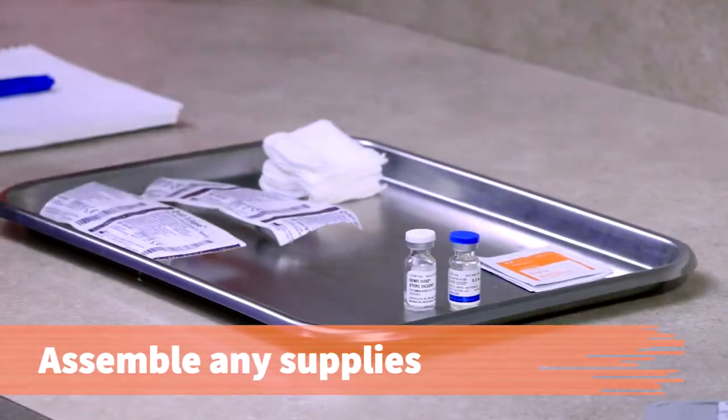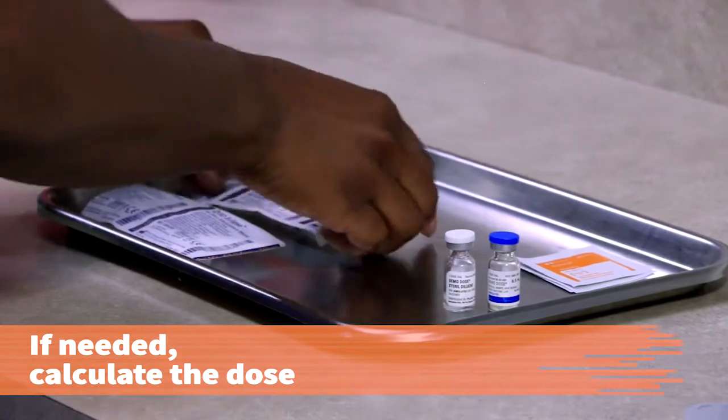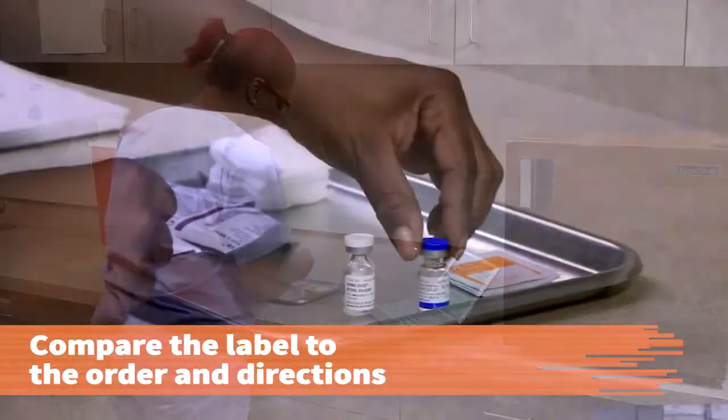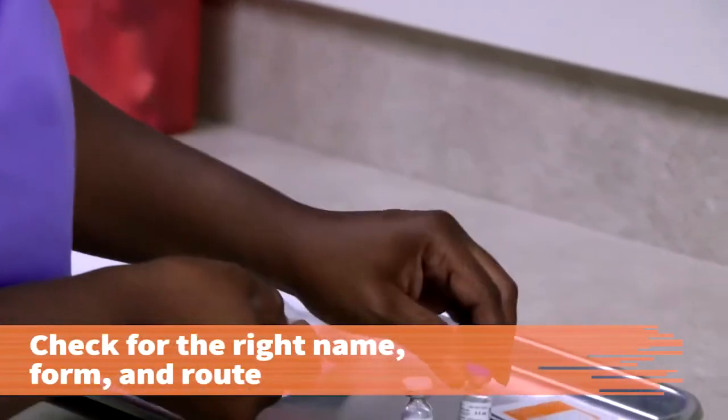Assemble the supplies required for the procedure. If needed, calculate the dose of medication required. Perform the second medication label check. Compare the medication label to the order and directions for reconstituting the powder. Check for the right name, form, and route.